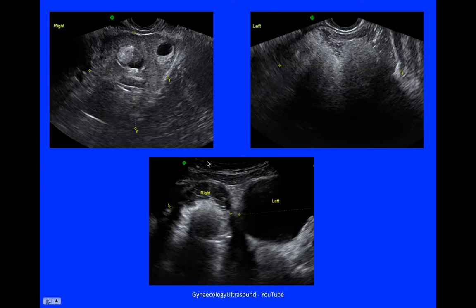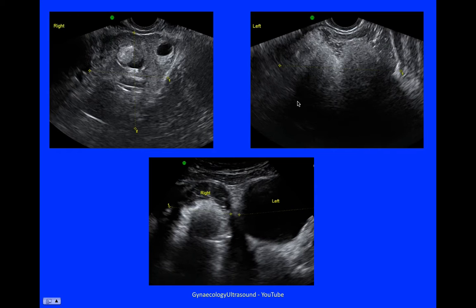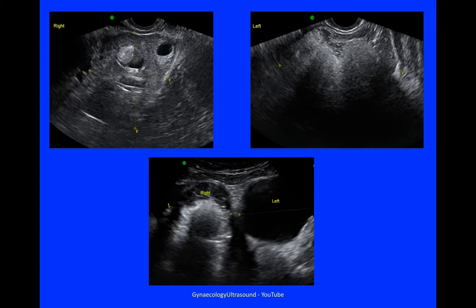This patient had bilateral dermoids. The one on the right measured 80mm and it's unilocular with mixed echogenicity, shadowing, and minor vascularity. The image on the left shows a unilocular cyst with mixed echogenicity, shadowing, and minor vascularity. This image shows the right and the left ovary next to each other in the transverse view. It's quite difficult on just a single image to see what these cysts look like, and the moving image is much easier to interpret.